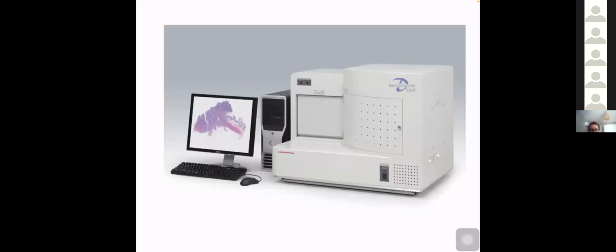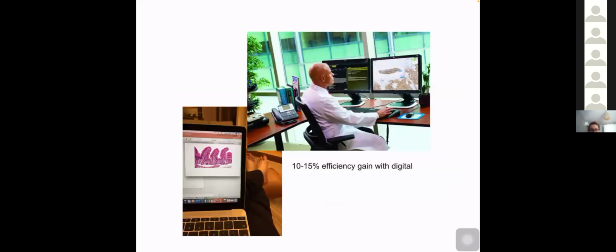So when we talk about digital pathology, basically most of us in histopathology, we hack wax. So we take wax sections, very thin wax sections, so we can transilluminate them, and we put them onto glass slides. The step in terms of traditional, I'm talking about traditional as in the past 10 years, digital pathology, is to then scan those slides.